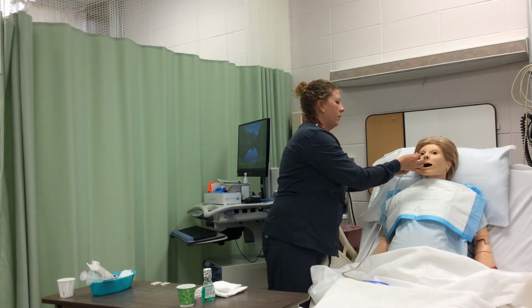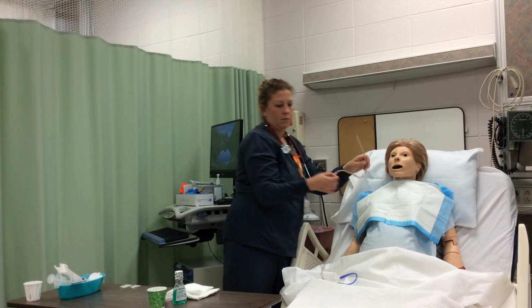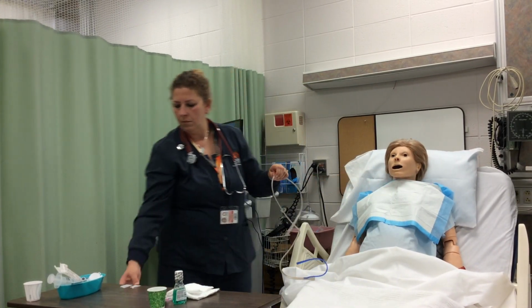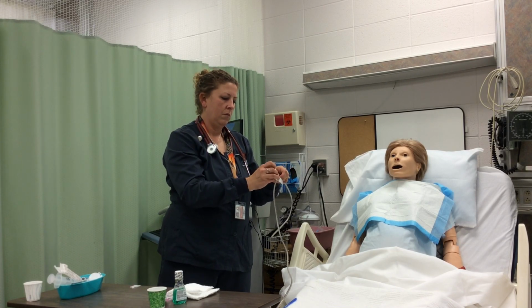So nose to earlobe, earlobe to xiphoid process of the sternum. Mark the required tube length with tape or indelible ink like a Sharpie.